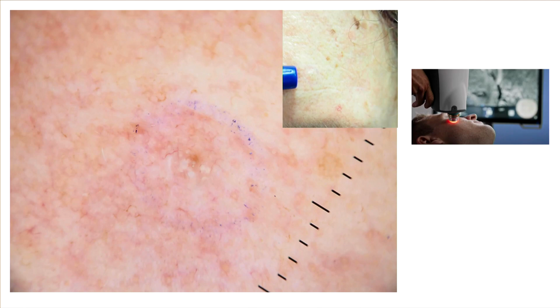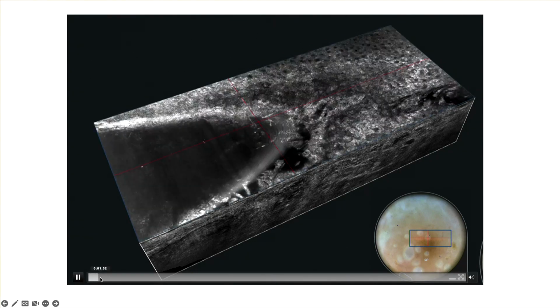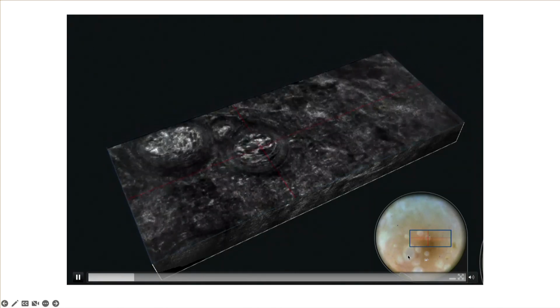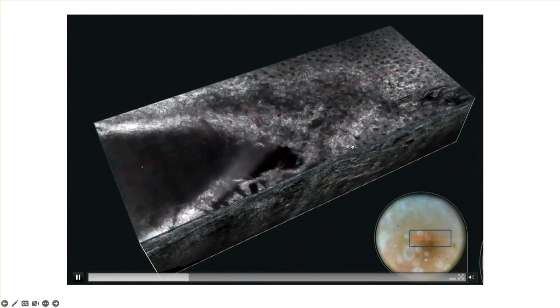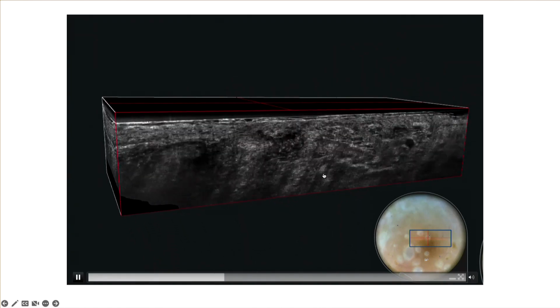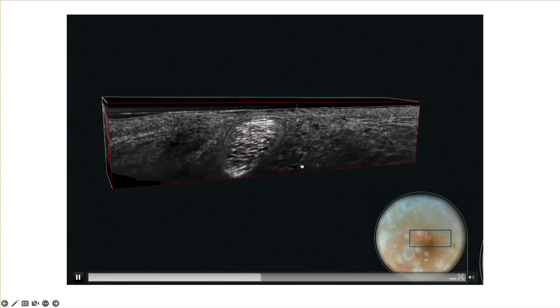And again, doing both techniques, because in Hospital Clínic of Barcelona we have this challenge, and it's perfect. We have both technologies. So look at this. This was a basal cell carcinoma, a very tiny one. If we see here these areas that Emilio Lalas described as calcifications in this micronodular basal cell carcinoma, we are seeing here with LC-OCT the stromal reaction, very, very similar to confocal.